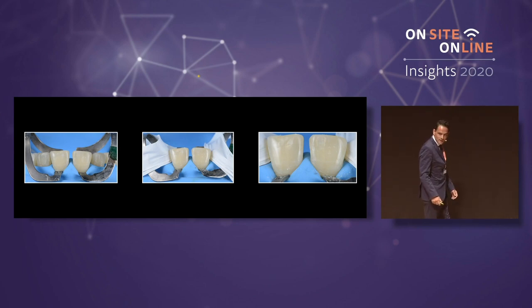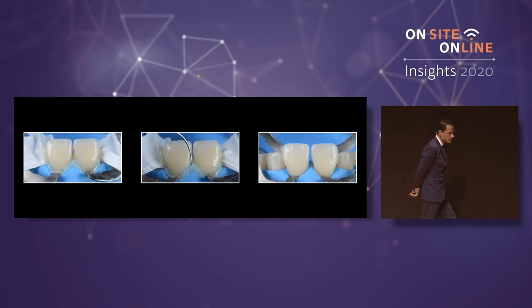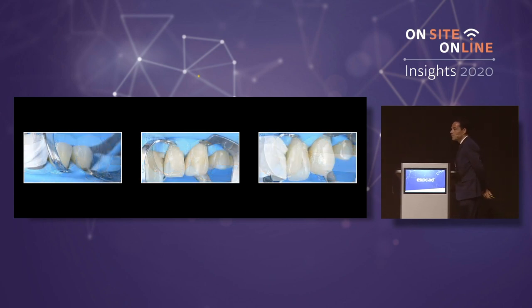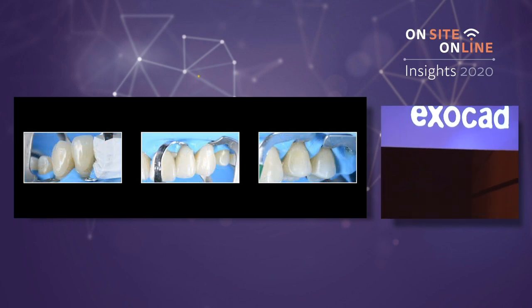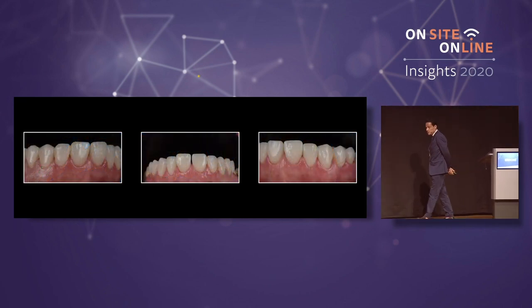Everybody knows well this protocol of adhesive cementation of veneers. One by one. And we never lose information. With this technique, the result is 100% predictable.